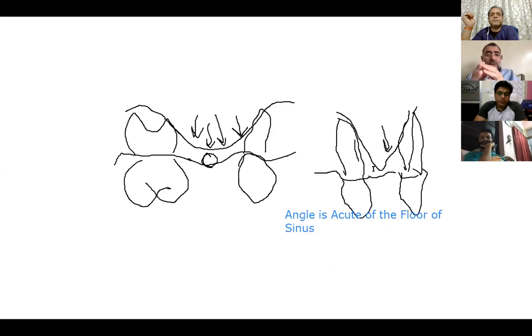There's always a chance, but when you regulate your pressure to elevate the membrane, you have more chance to not perforate the Schneiderian membrane. If you use a lateral approach, you have the same problems because you have an angle too, and sometimes you have many problems with your instrument to elevate the membrane in this angle, with the mechanical instrument or piezo instrument into the sinus. But with pressure, you can have fewer problems, I think. I use HP's technique in this case. I have to regulate the pressure into my tip to elevate my membrane gradually.